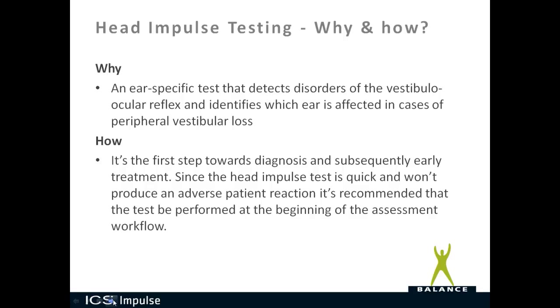How or where in the workflow do we provide this test? It's the first step towards diagnosis and subsequently early treatment. Since the head impulse test is quick and won't produce adverse patient reaction, it's recommended that the test be performed at the beginning of the assessment workflow.